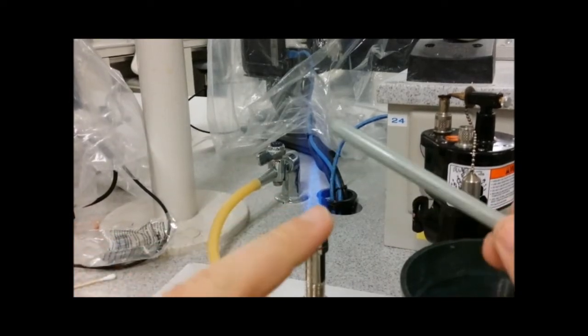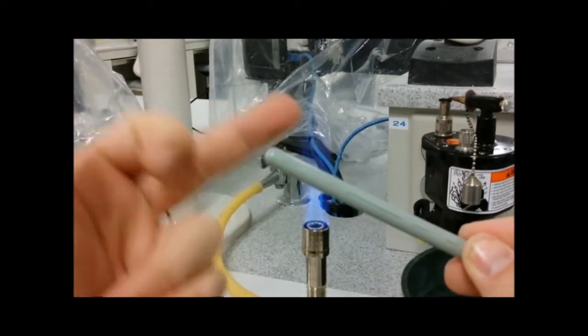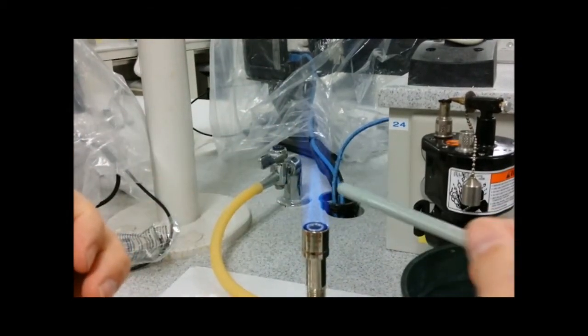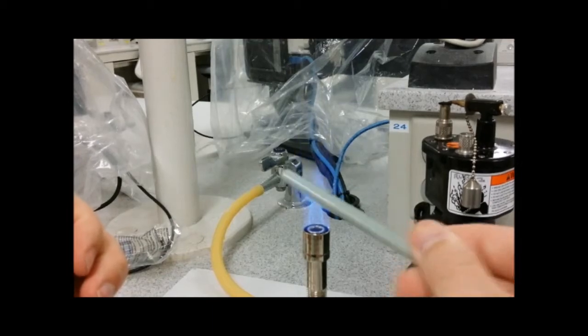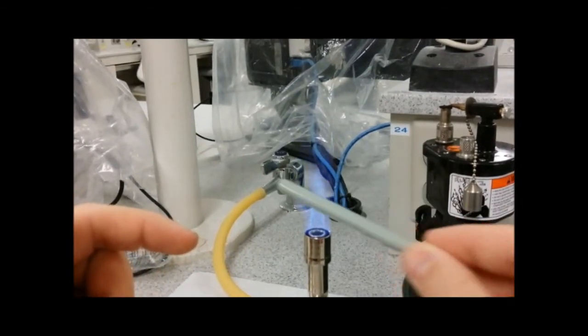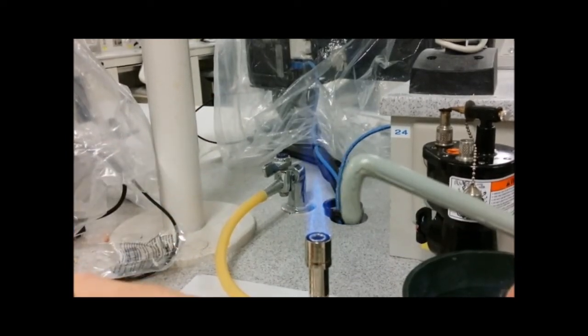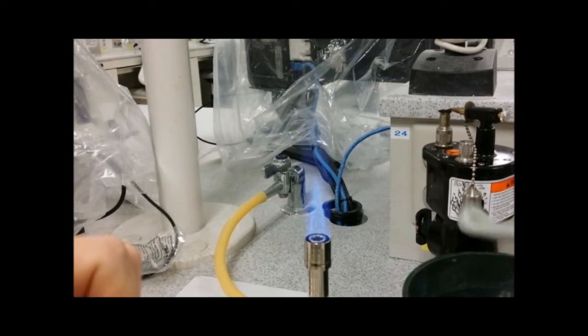And you'll slowly see, like this edge, you can see this will start blending in and then where you're heating at is going to turn glossy, a real shiny color. And then you wait a few seconds, once it gets glossy, heat slowly like that. You'll see it get glossy and then all of a sudden it'll go limp.